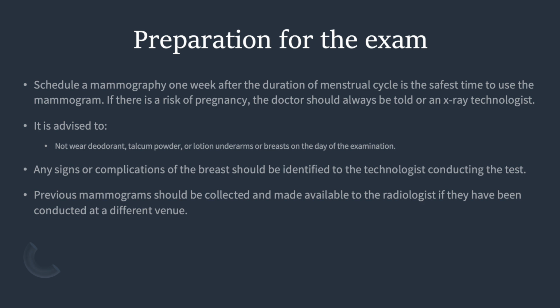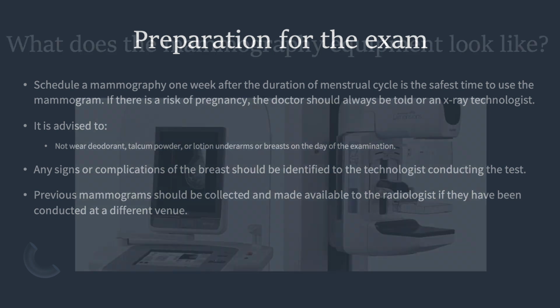Any signs or complications of the breast should be identified to the technologist conducting the test. Previous mammograms should be collected and made available to a radiologist if they have been conducted at a different venue, which is important for comparison with the current test.